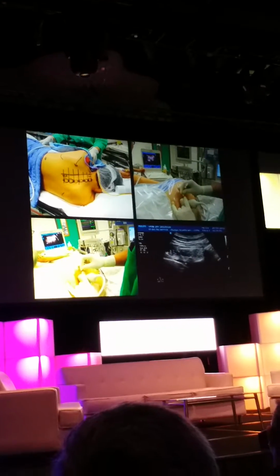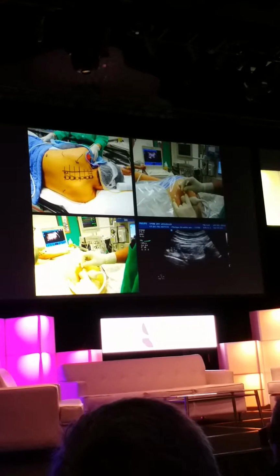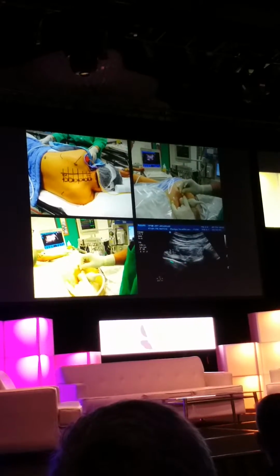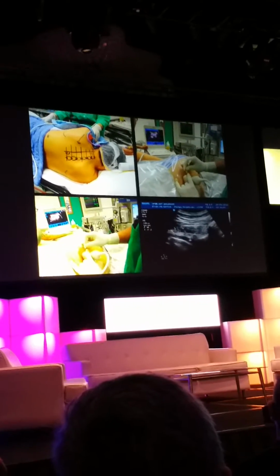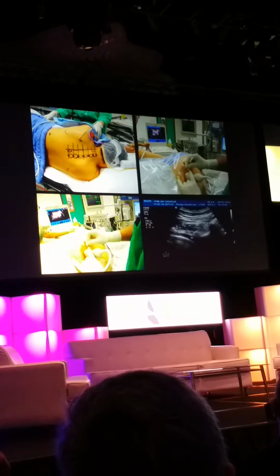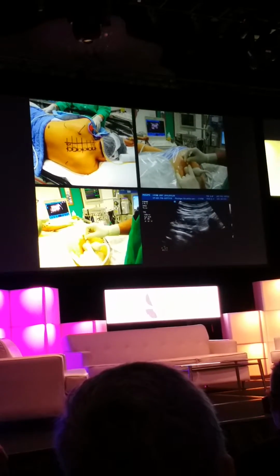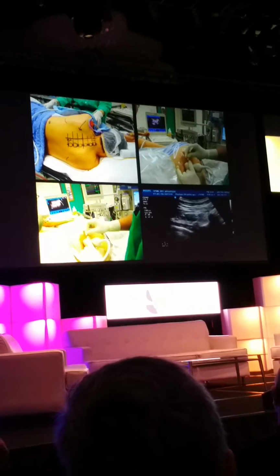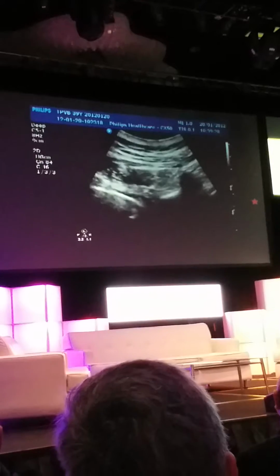We always inject saline before the local anesthetic. This will confirm your needle is in the paravertebral space. If you see anterior displacement of the pleura, widening of the paravertebral space, and even increased echogenicity of the pleura because there is post-enhancement with the reduction in the acoustic impedance in the paravertebral space, this confirms that your needle is in the correct position. We then inject the local anesthetic.